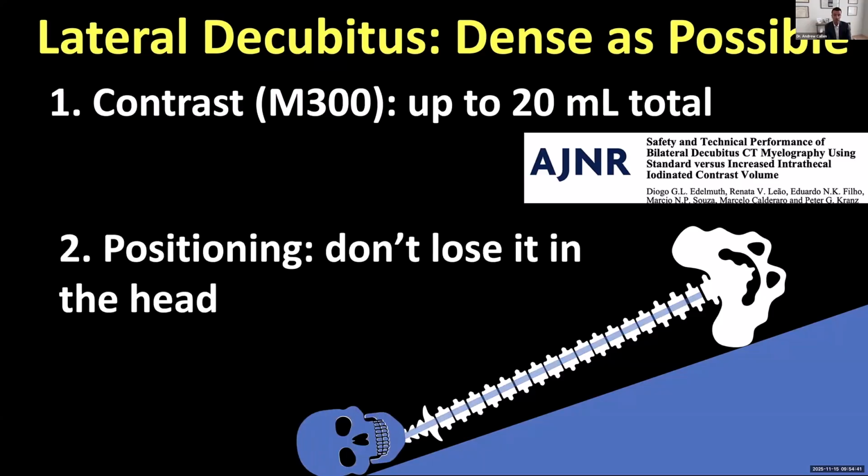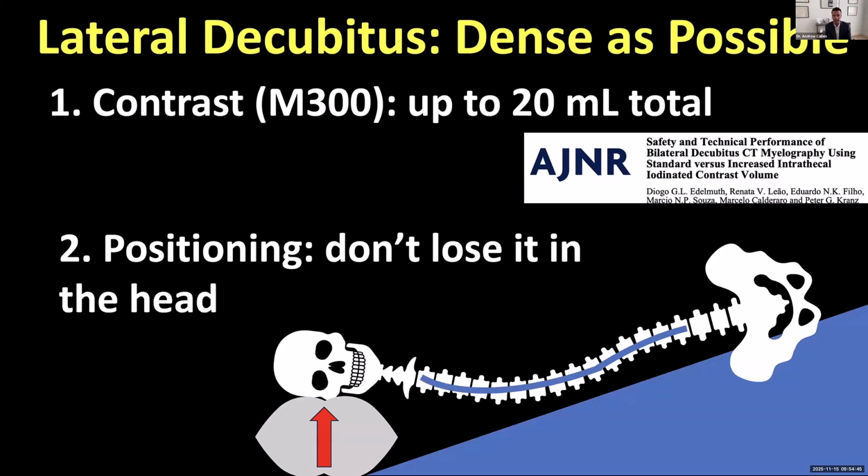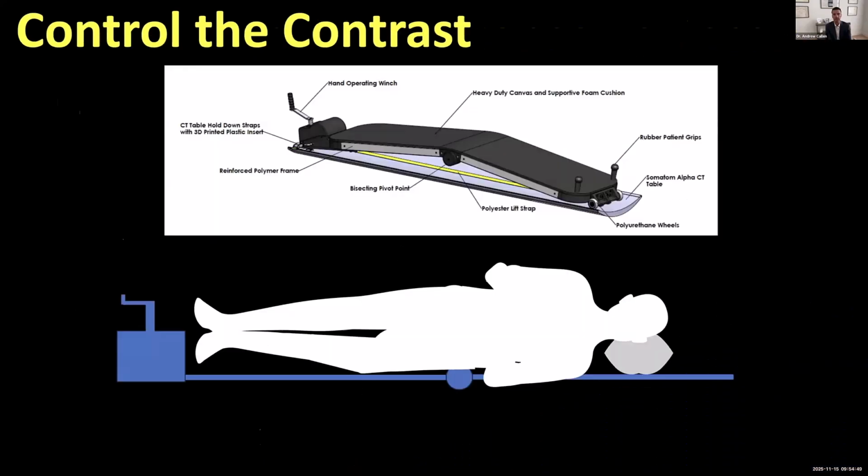And we're going to position the patient just so. We're not going to just have their head all the way down. We're going to prop their head up so that dense contrast stays in the spine as much as possible, so that we get a very sensitive exam.